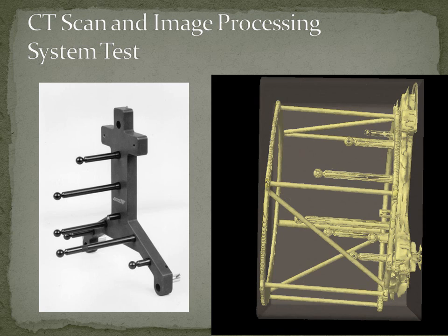One of the ways we test this constantly is by having what we refer to in imaging as ground truth. And what we have here is a rigid phantom. It doesn't look like a ring, but it has all the features of a ring. It has places for those tooling balls to sit. It's got little mounts so that we can mount it into the stereotactic deliveries, into radiosurgery delivery systems. And we know exactly the BRW coordinate of each of these spheres. And we can take this and we can tilt it, and we can spin it, and we can tilt the gantry.